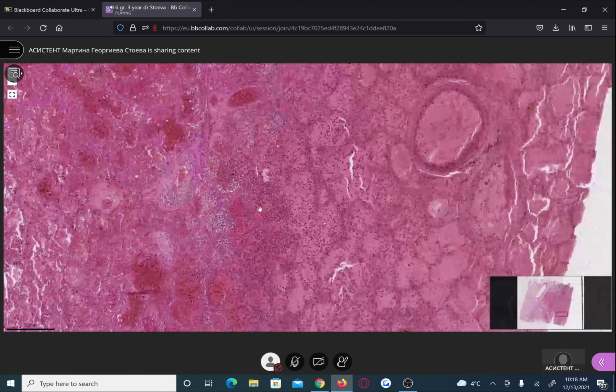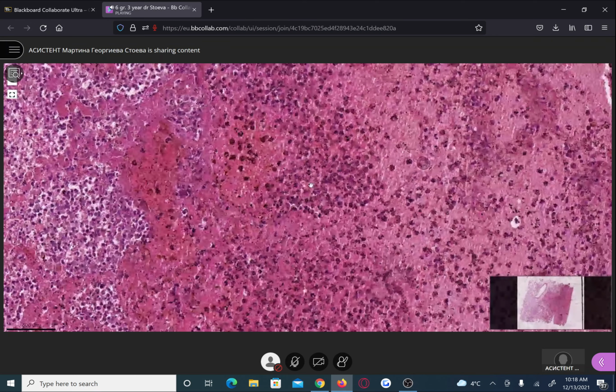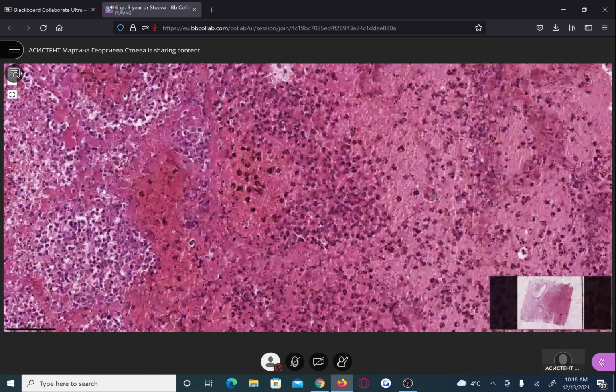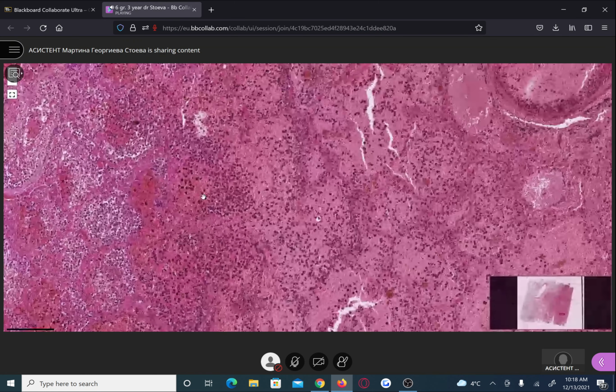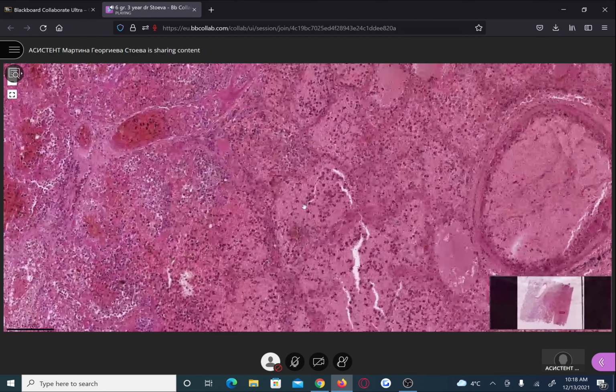There are, of course, some white blood cells, but again, this is due to the inflammation associated with the necrosis. And the siderophages, again, are formed because of the extravasated erythrocytes. You know that the hemosiderin is formed after the alveolar macrophages phagocytose the erythrocytes, and then the hemoglobin is transformed into hemosiderin.